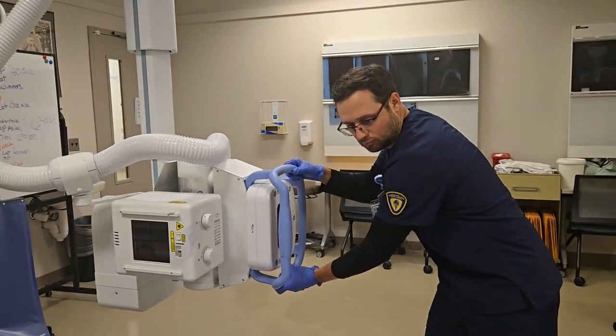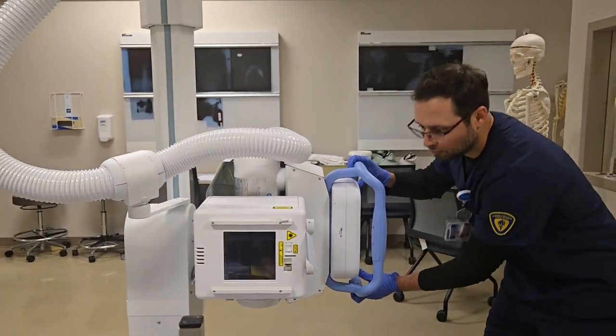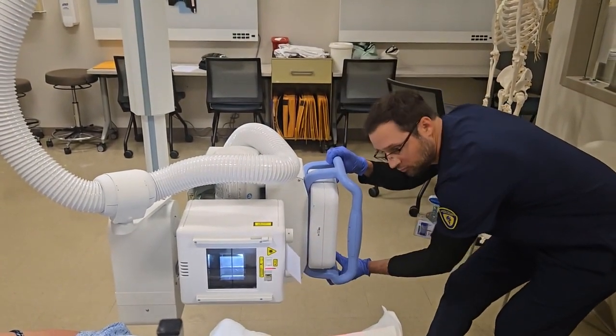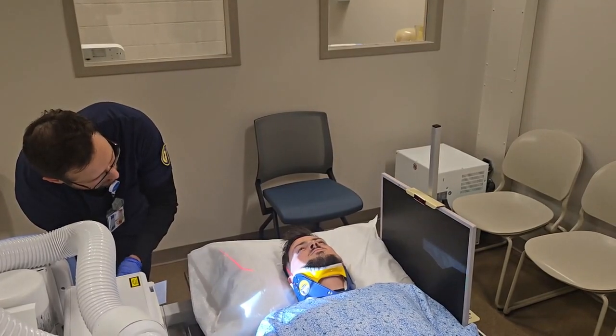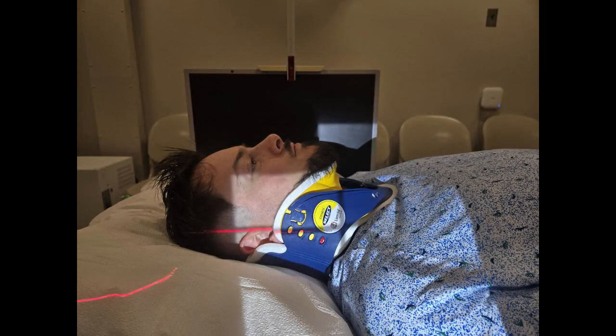A 72-inch SID is utilized for the lateral, but in instances of limited equipment mobility, 56 or 40 inches can be used. Ensure that there is very minimal OID to reduce magnification. Collimate to include from the base of the skull to T1 and from the anterior soft tissues to the posterior spinous processes. A typical field size of 10 inches by 12 inches is used.